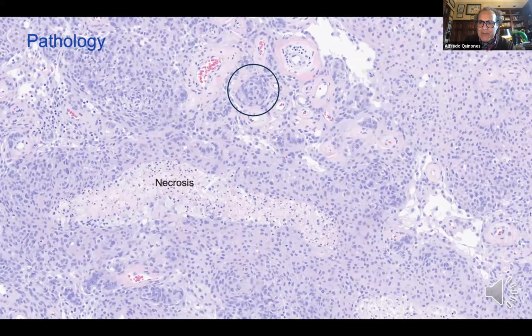And you saw that vessel, which, by the way, before we went in, we knew that he was going through the tumor. I didn't think it was going to be so intimately welded to the tumor, but we knew that it was inside the tumor. So he was already planning, and you saw how after the tumor was debulked, he was able to open the tumor like a book, track it from proximally to distally, and then go from both sides, as he was saying, separate in half. And then he had a little remnant on the other side of the artery. And then we were able to clean it up a little bit. And at the end, we left some microscopic disease against the artery and put papaverine. But it was a beautiful dissection.